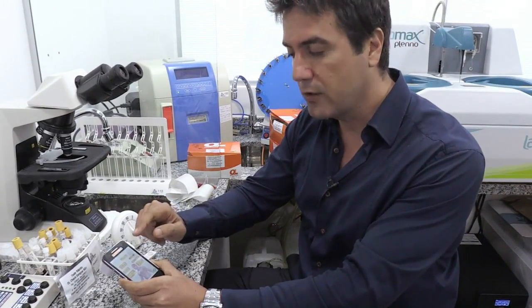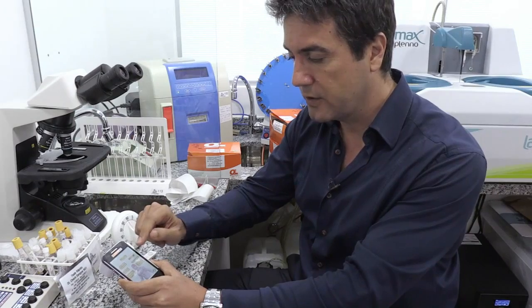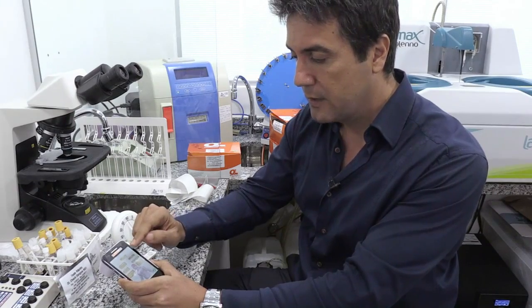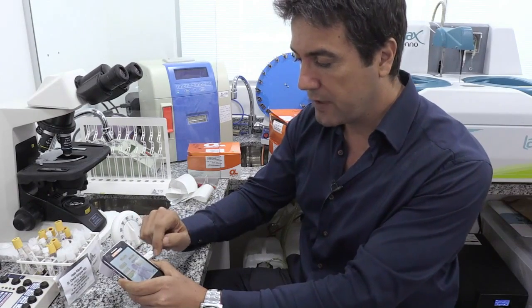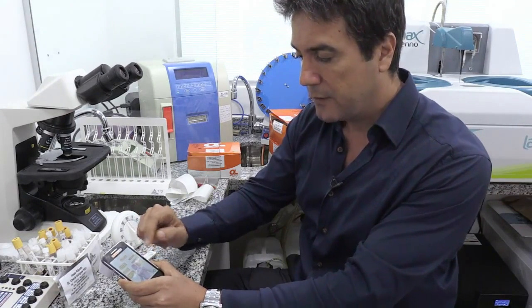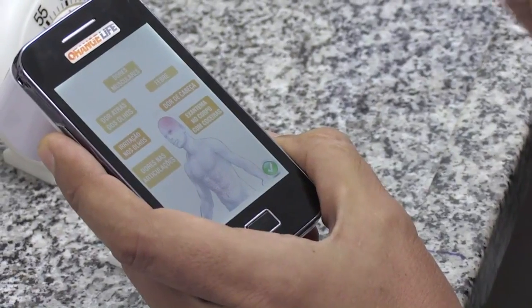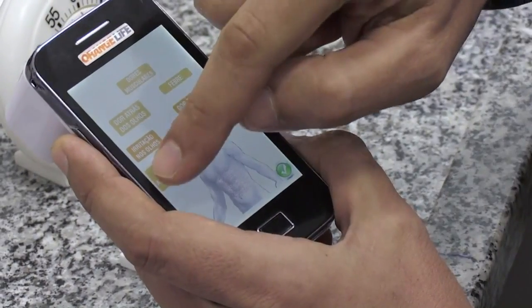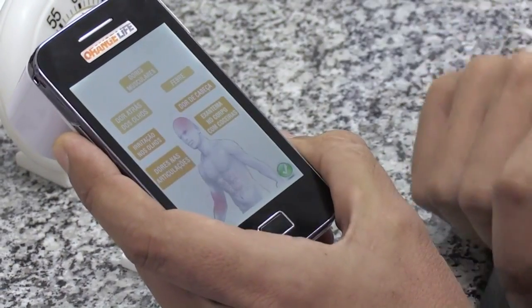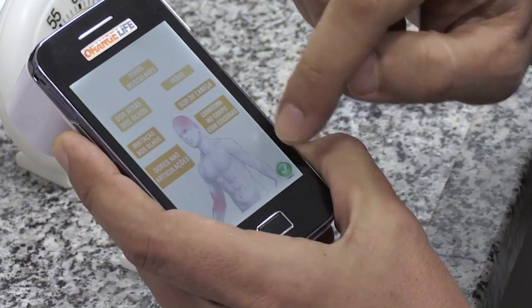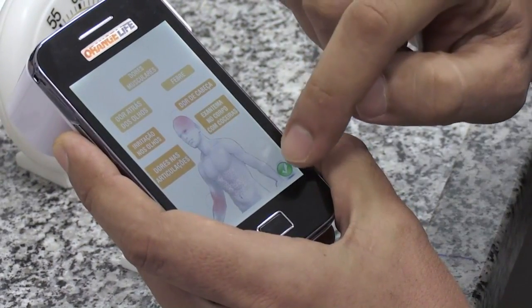I will now enter the main symptoms the patient has, such as fever, headaches, and she said she had joint pain, especially in her fingers, so we specify that as well.